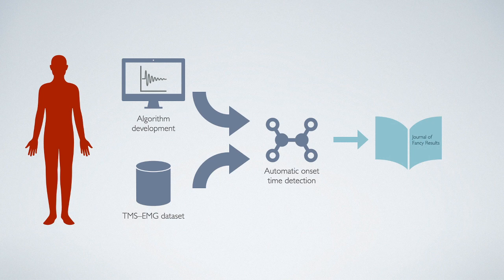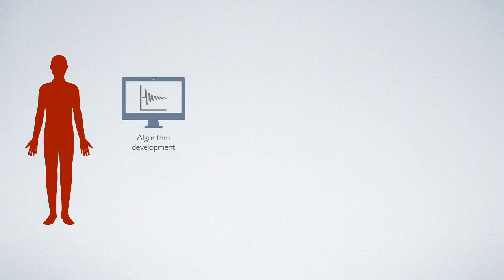You might recognize the problem here. An algorithm that is based on an input from a single researcher or a research lab will end up great at mimicking that researcher specifically. It might not be generalizable to the style of other researchers. Clikr can aid in this aspect.